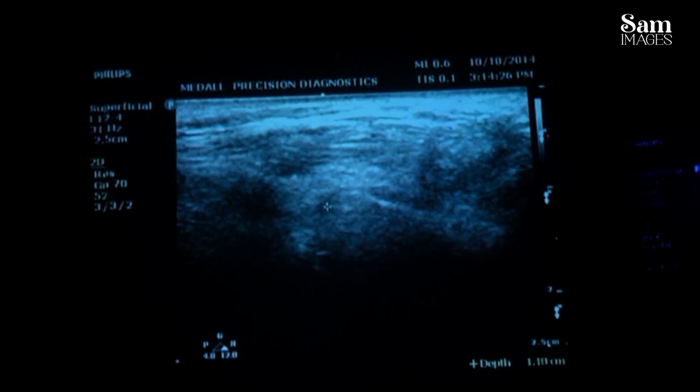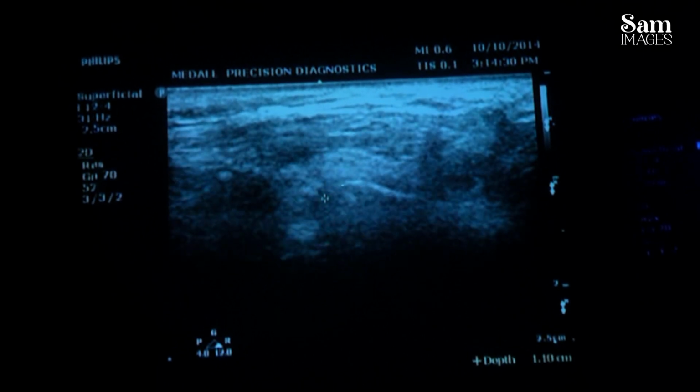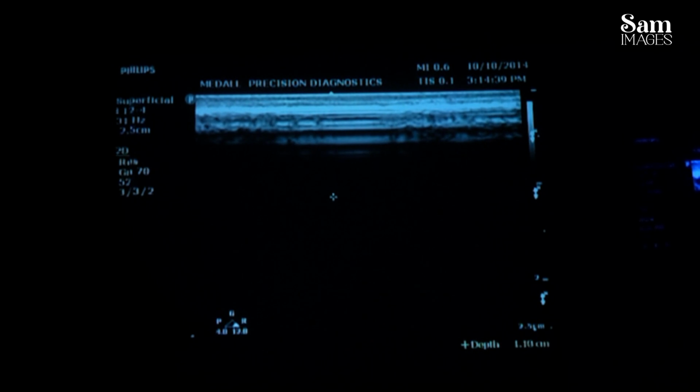It was going out of the mandibular fossa and then coming back. But here it is not going at all. There is definitely restriction, and also irregularity. This is typical of a bony ankylosis. Okay.